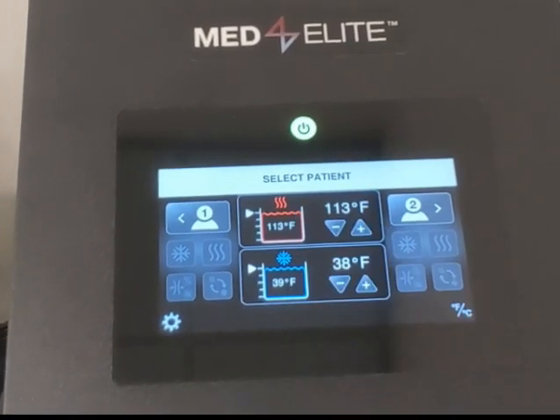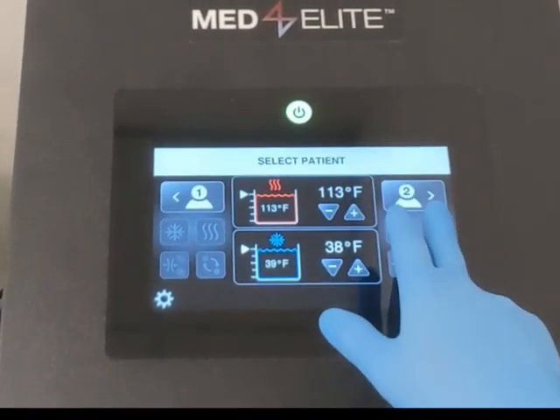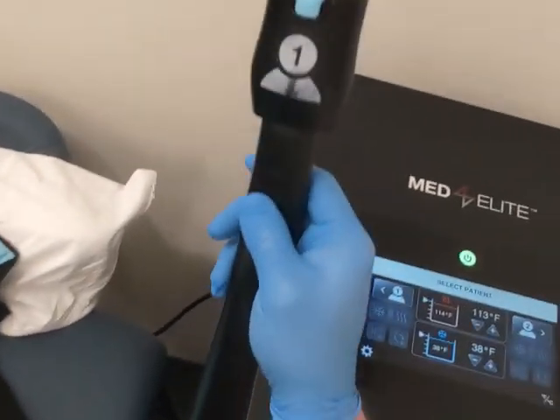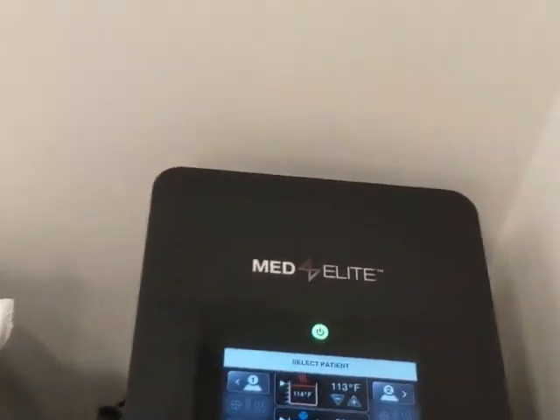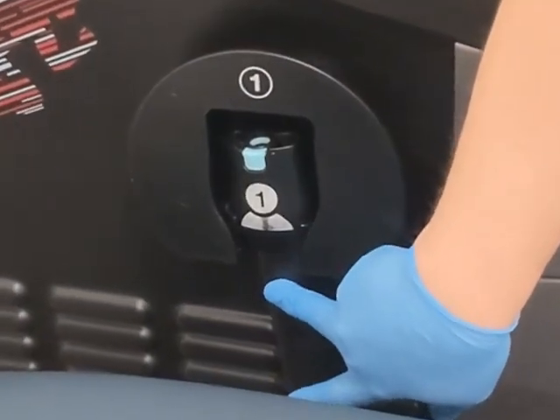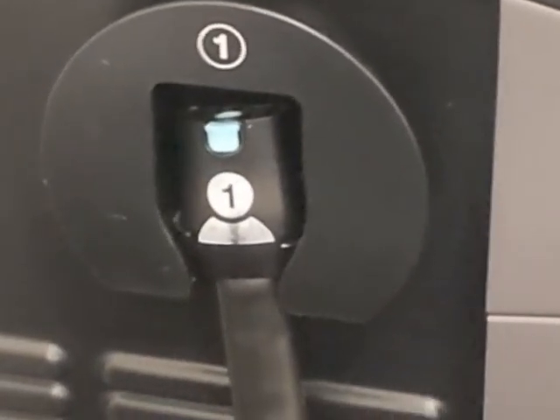You'll notice there is a one and a two person setting, and that correlates to the hose connector. On the left side is one, on the right side is two. You'll notice they're hung with the dongle face up — that's so that any residual water within the hose does not leak out.